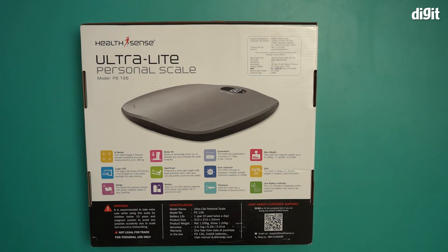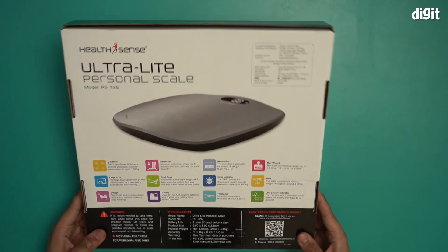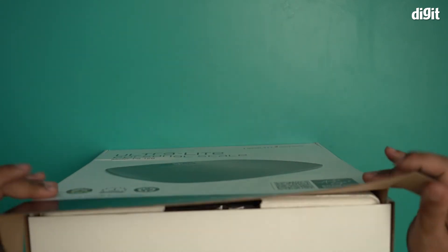It also has a low battery indicator. Once the battery is drained, it will display a 'LO' indicator — that's when it's time to replace the two triple-A alkaline batteries. Okay, that's all the information from the box, so now let's go ahead and open this up.